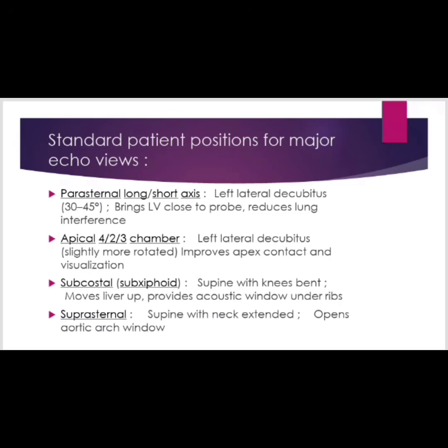Next is subcostal view. The patient lies in supine position with knees bent. It moves the liver up and provides an acoustic window under the ribs. Last but not least, suprasternal view. In this, the patient lies supine with neck extended. It opens the aortic arch window.